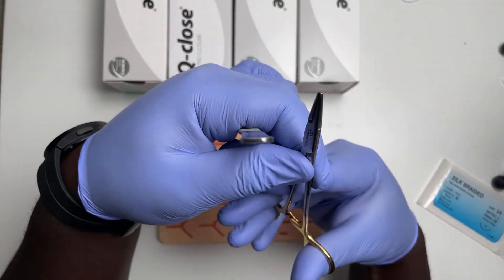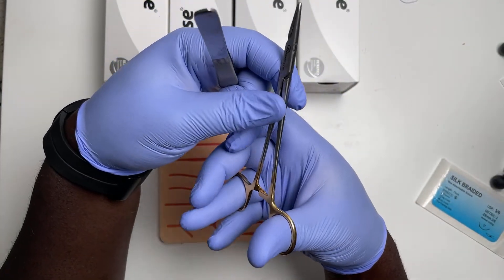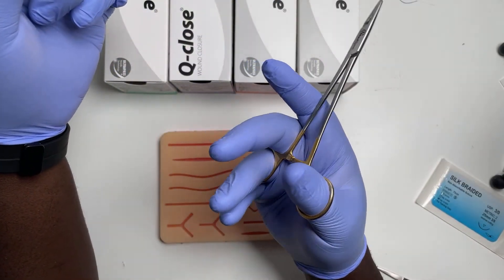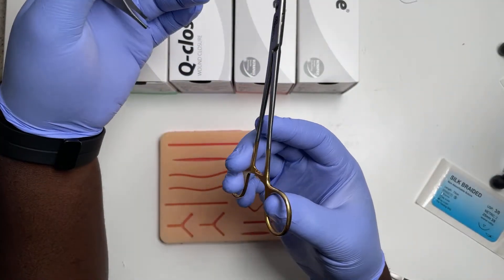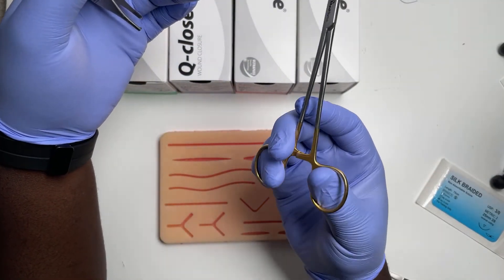In terms of the needle holder, don't let it go down your fingers. This is what happens when you're stressed. When you do that, you lose range of movement. Keep it in the pads of your fingers and you can just gently lock and unlock the ratchet.